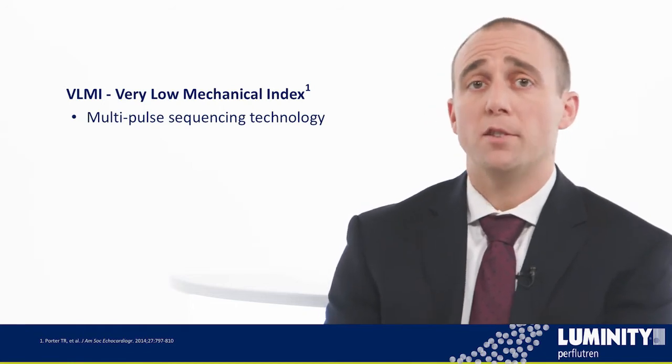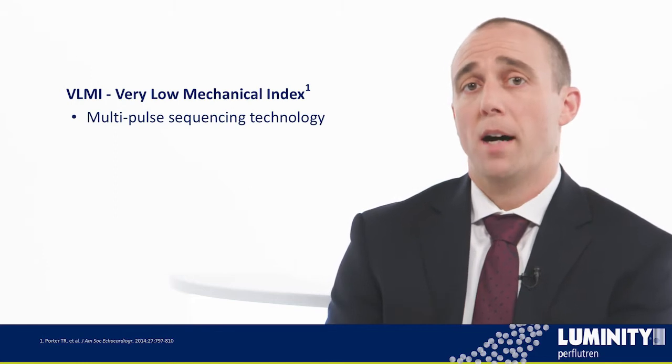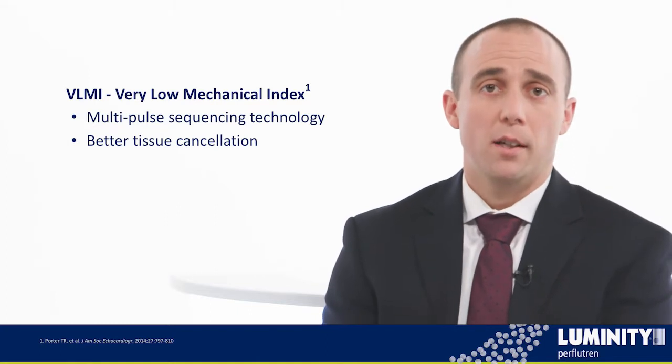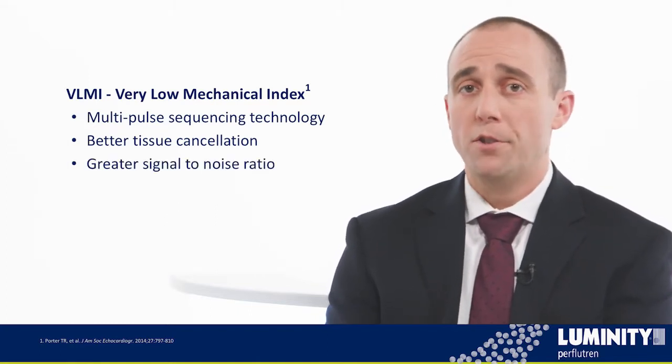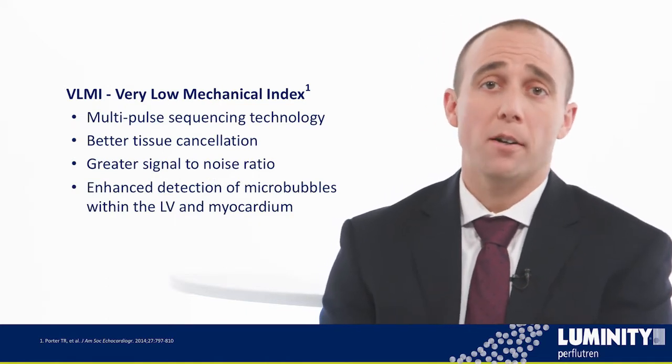Right? VLMI is a specific technology that requires the installation of software to the ultrasound system via the ultrasound system manufacturer, if available, as not all ultrasound systems have this technology. The advantage of VLMI imaging compared with low MI harmonic imaging is that it offers better tissue cancellation and greater signal-to-noise ratio for an enhanced detection of microbubbles within the LV and the myocardium.